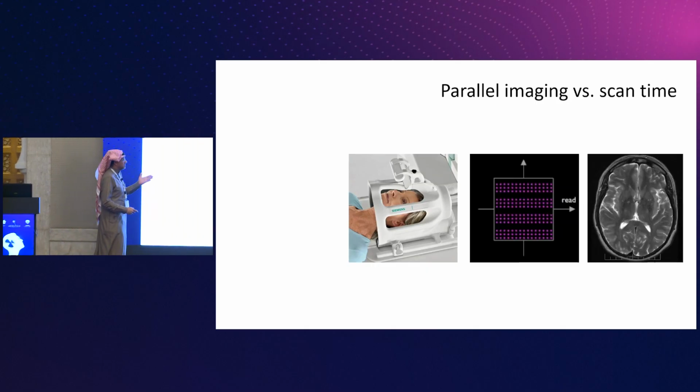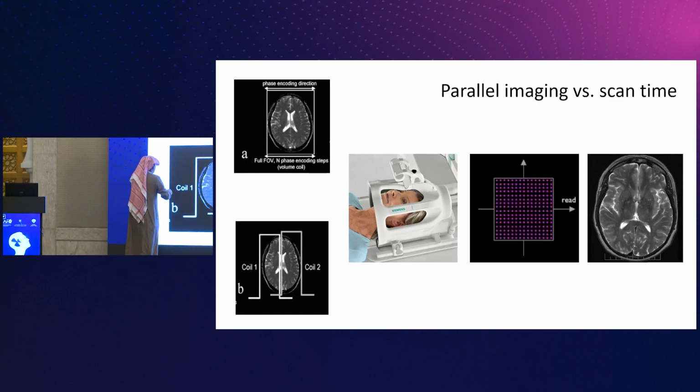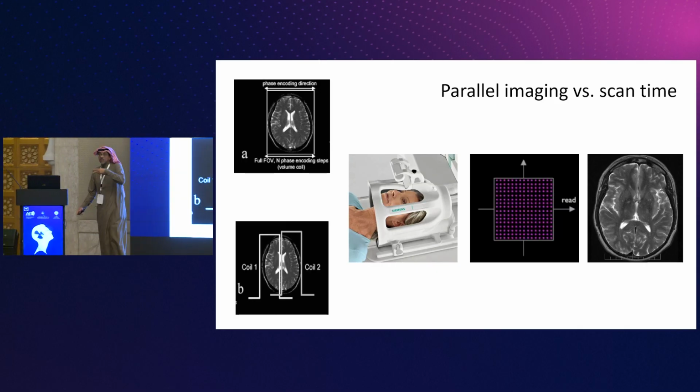And we get this image. In parallel imaging, the same coil, which is one, is divided to two. So I have two coils. And each coil has a wire taking the signal to k-space.